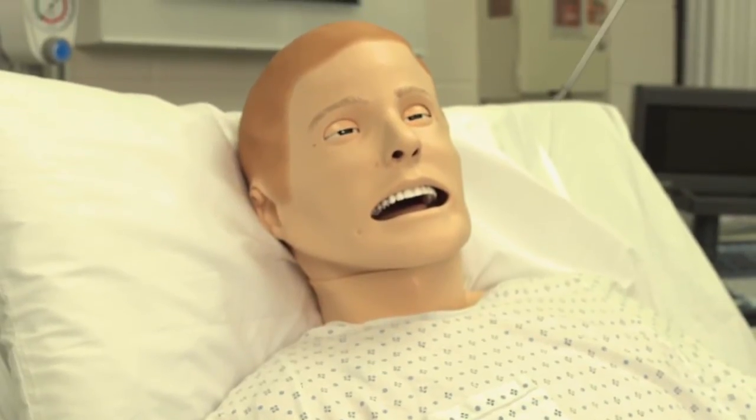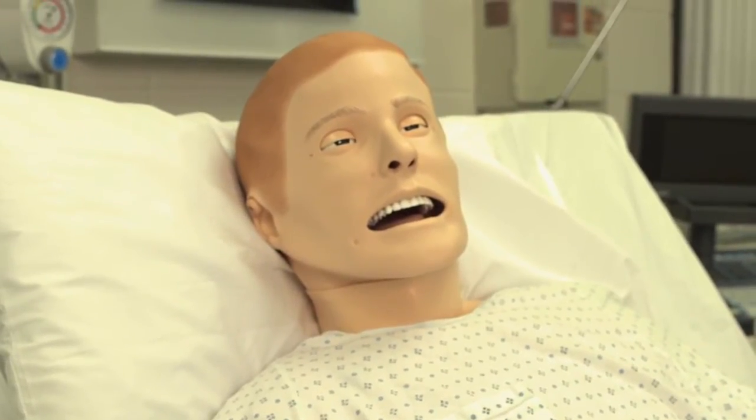We had a sim patient screaming in pain on a 12 out of 10 pain scale, and after assessing her vital signs, we administered the morphine that was ordered, and within 2 seconds her vital signs dropped and she was experiencing symptoms of morphine overdose. So we had to think fast and on our feet and give Narcan to help correct the overdose.